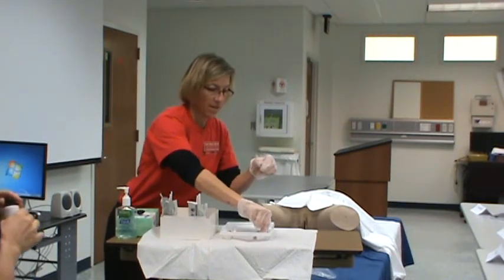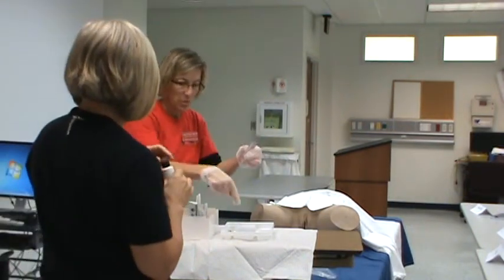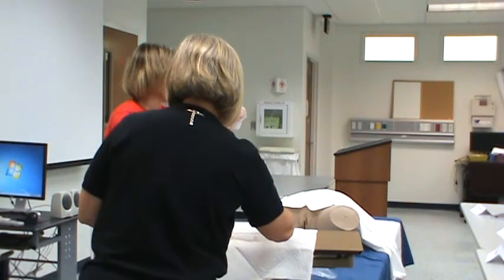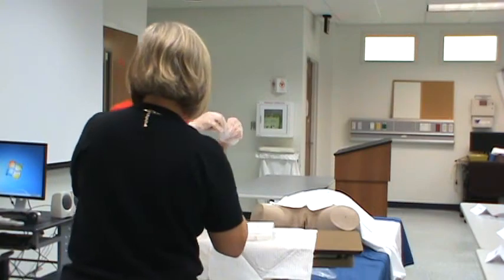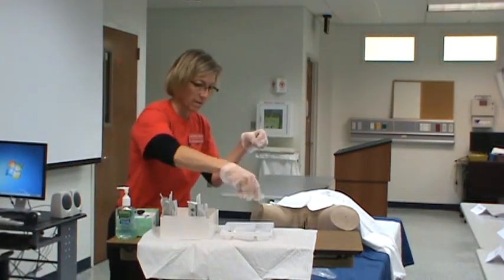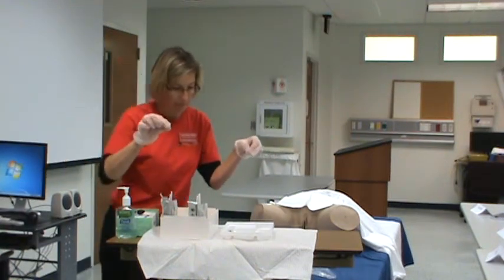The lubricant, this lubricant you guys will not utilize. We'll just put it there, that's great. But we want to see that you're going to open it like you would in the clinical setting. So I'm going to find my area, I'm going to open it, and I'm going to squirt the lubricant. And then get rid of it.